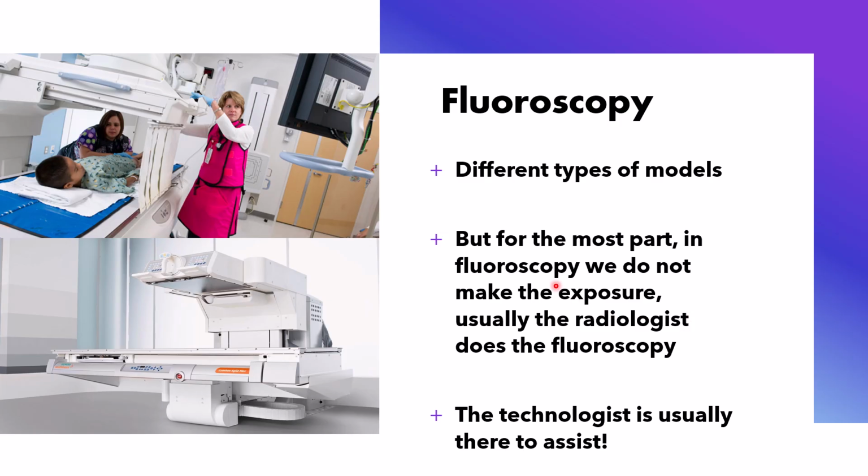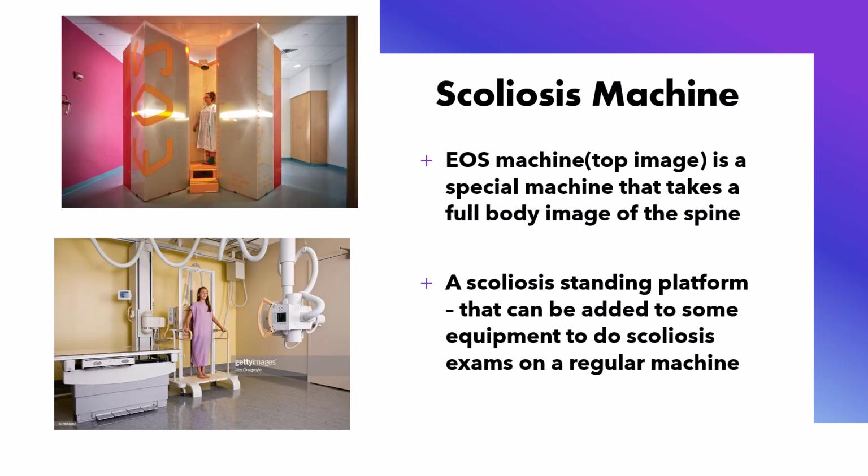Usually, the technologist is not the one who makes the exposure. There has to be a radiologist or a radiology assistant that makes the exposures here. We're just there to assist, and then we can do any overhead or static X-rays that are required.